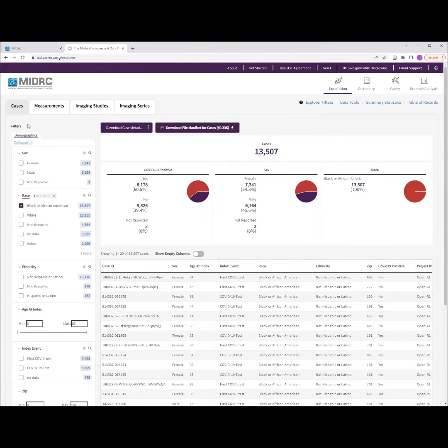Note that additional criteria can be filtered using the Cases, Measurements, Imaging Studies, or Imaging Series tabs at the top of the screen.